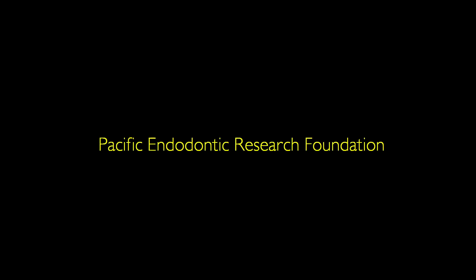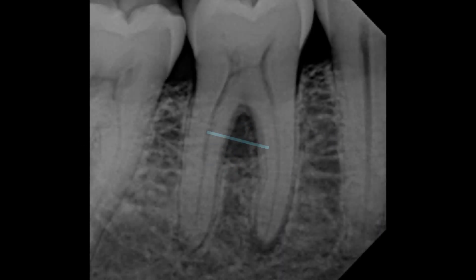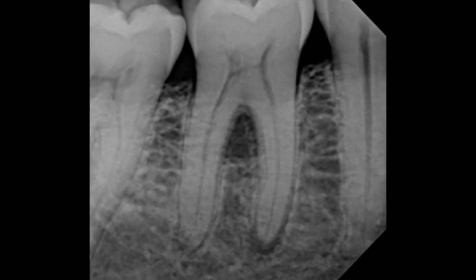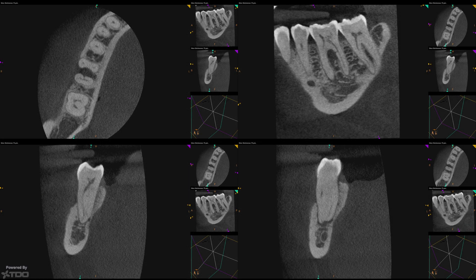This is Pushback's case 628. I already did a preliminary findings report on it; this is the final report. This is Pushback's periapical pre-op, and this is the CBCT that he took.